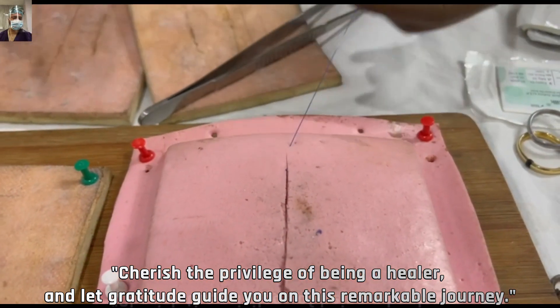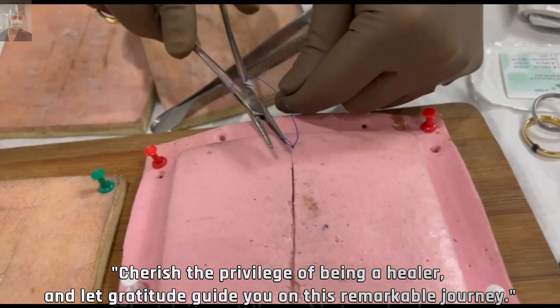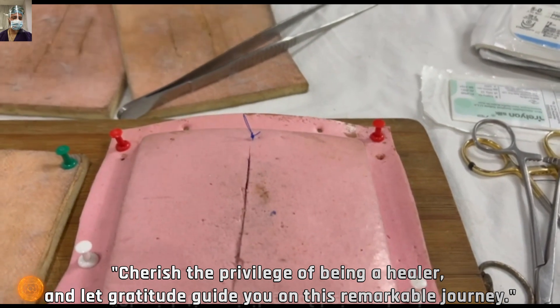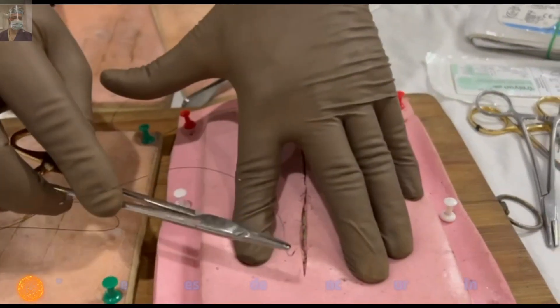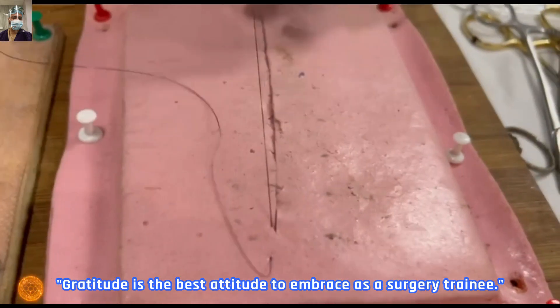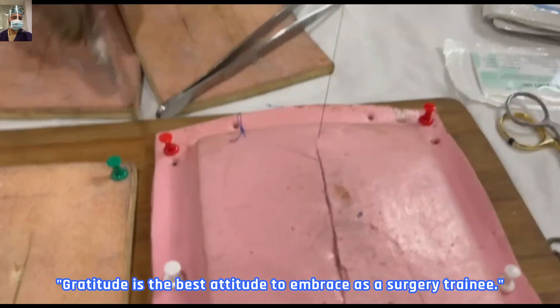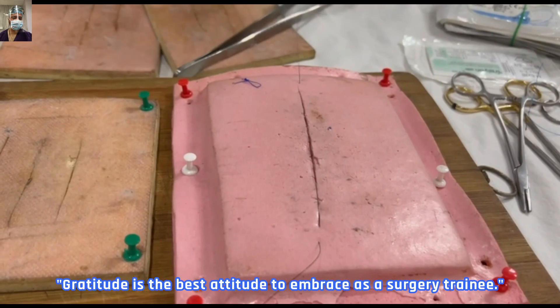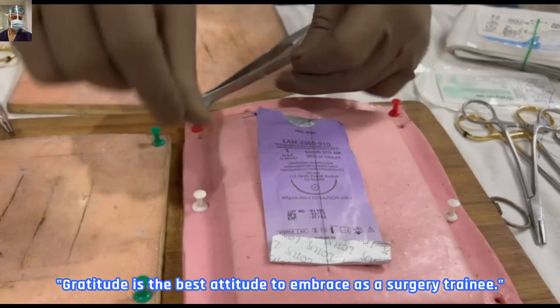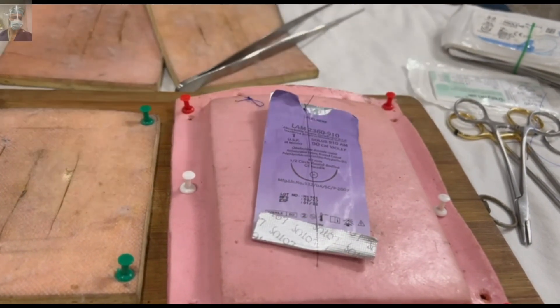Another method of closure for the subcuticular technique is to simply apply a knot on the thread and pull the end closer to the wound and cut it — it will automatically fall off, especially if you are using monocryl. Another technique, if you don't want to apply any knot, is to start subcuticular closure from one end, come through the normal skin, and leave a short length of suture. After suturing the whole length and coming to the other end, come out and keep a roll of gauze there. Loosely tie these two ends over this roll of gauze and apply the dressing. You can simply cut these sutures after 3 to 5 days and it will heal beautifully.